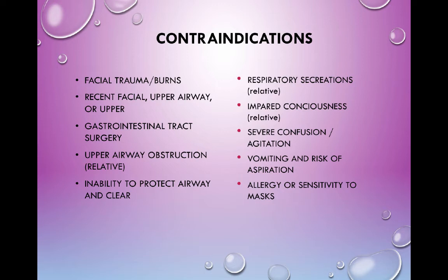We just had a guy, an older gentleman with pulmonary disease, and we were trying to keep him from being intubated, and we were sticking him on CPAP. And nobody ever knew that he fell and broke his nose. There were no marks, and so we couldn't figure out why this guy's flinching. And so we figured out he has a broken nose, and here we are trying to stick this thing on there. So it's tough.